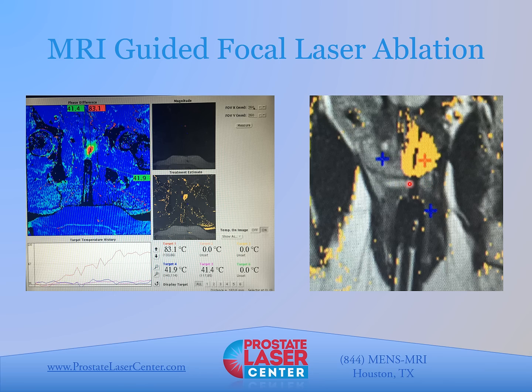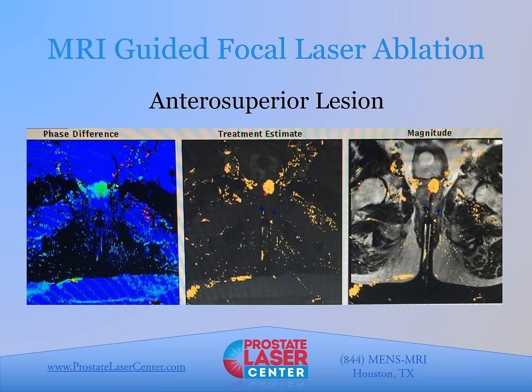Furthermore, you can see this white fluid around the neurovascular bundle, which I inject for a couple reasons. One is it's dilute lidocaine, so it does provide analgesia. Also, it allows one to visualize the neurovascular bundle better with the MRI, but also the fluid itself provides a little bit of a thermal barrier to help protect the nerve from the effects of the laser heat. Here's another lesion that I ablated. You can see the bladder is right under here, and we're able to successfully ablate a tumor in this part of the prostate without damaging the bladder.